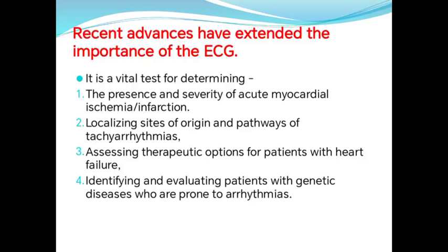Other uses include prolonged monitoring of the ECG, diagnosing problems by using what is called 24- or 48-hour continuous ECG monitoring to diagnose problems such as heart block or arrhythmia that are intermittent.